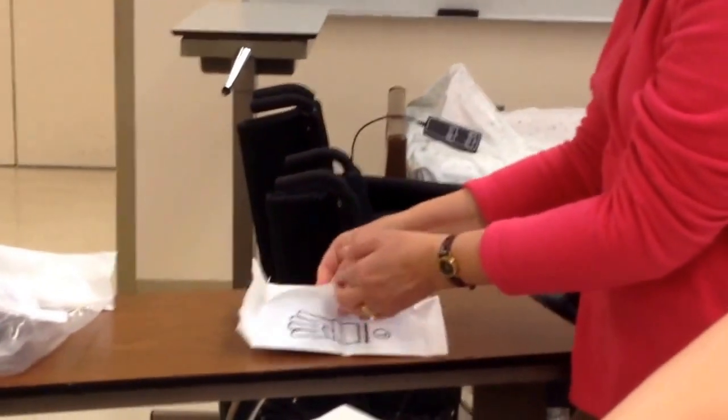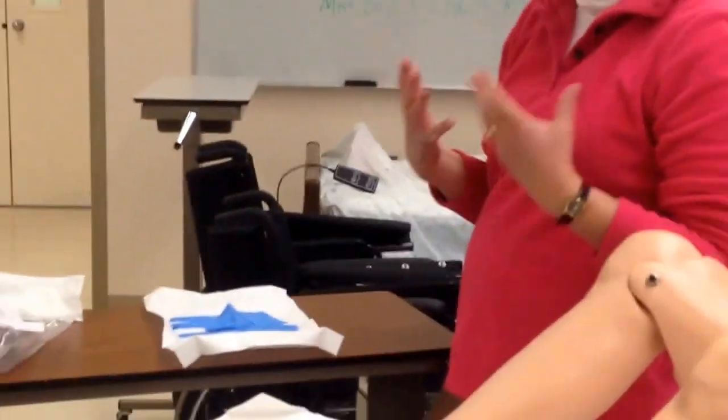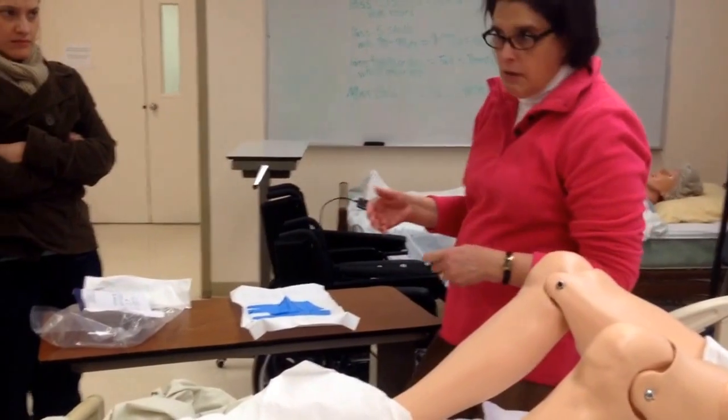Which hand to glove first? Dominant or non-dominant? Okay, well, I use my dominant hand first. I glove the dominant hand. I cannot do this opposite, okay?